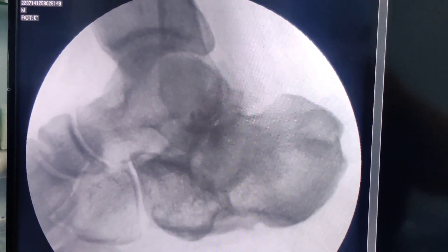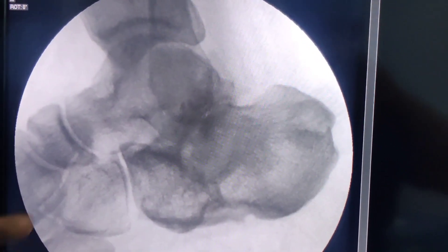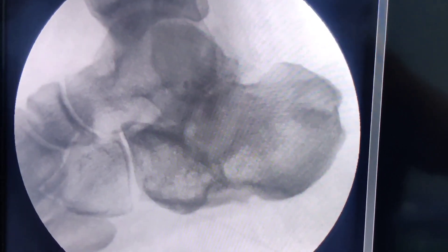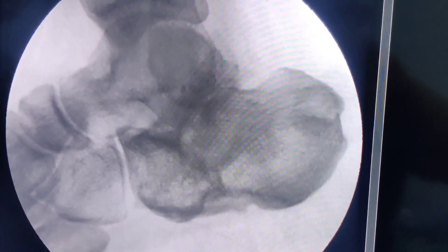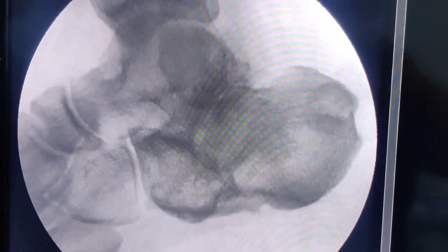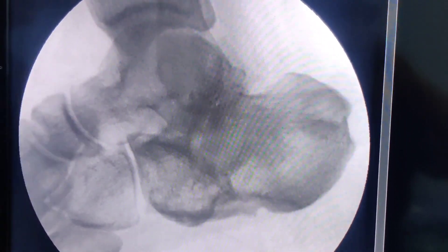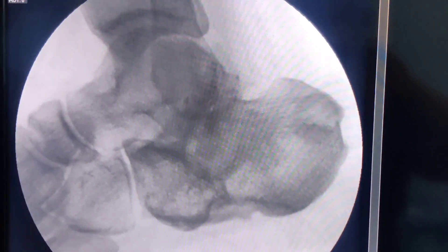Once you inject the steroid into the subtalar joint, it will wash away the Omnipaque from the joint, and the contrast line seen before will disappear. This is also an indirect indication that you have injected the right joint — if your needle had moved, the dye would not have been washed off. This is another confirmation that you have injected the subtalar joint correctly. I save this image and put it in the patient notes. That is how you inject a subtalar joint safely.